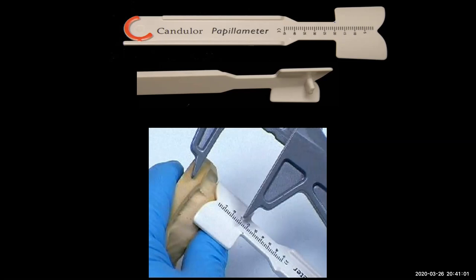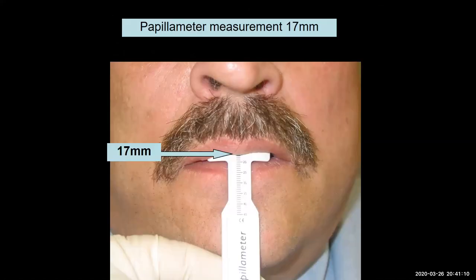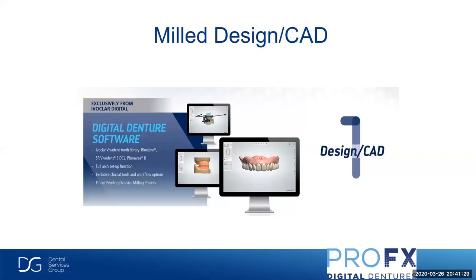But I was touching on the papillometer. So this papillometer reading, we just rest this tool on a papilla and it gives us an indication of where the incisal edge is going to end. So I usually add a couple more millimeters to this. So this particular photo, I would say about 19, 20 millimeters. And then we take that information at the laboratory and we'll help contour that bite registration and that occlusal rim for you. So it's less work for you in the dental office, contouring these bite rims.